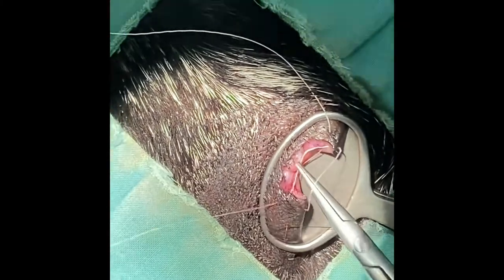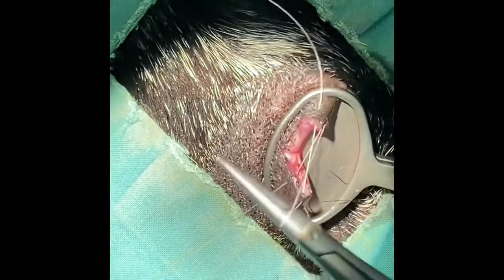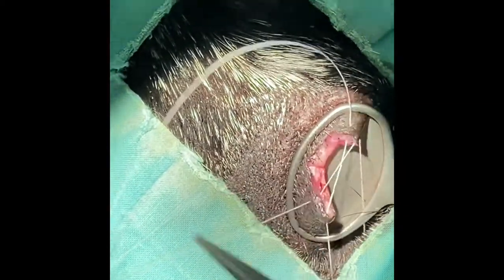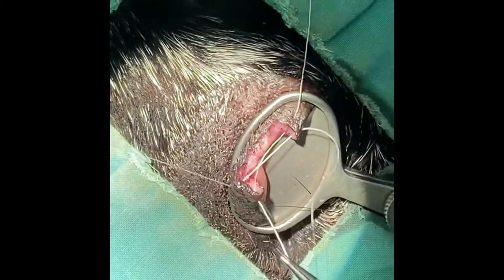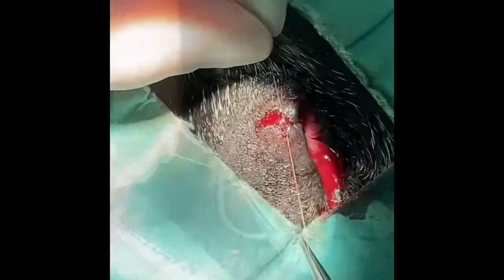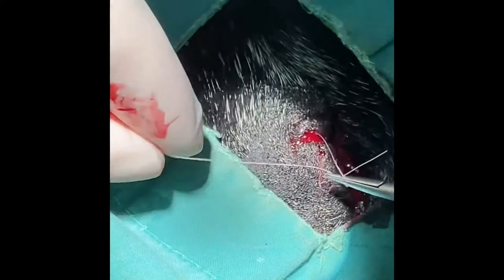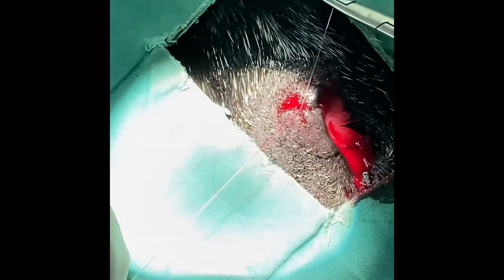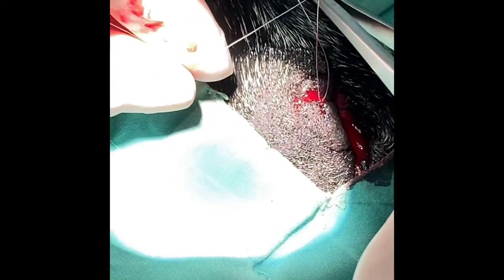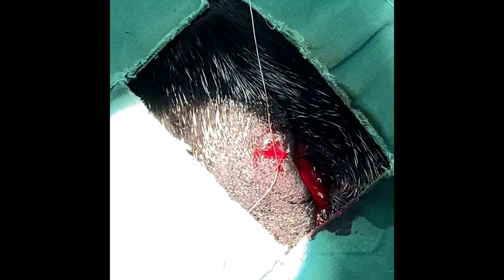When we tie it, the knot and the ends of that suture material should be nicely well away from the eyelid margin. As you can see, we've now got an accurate placement of the suture so that the apposition of that eyelid margin is as good as we can be.